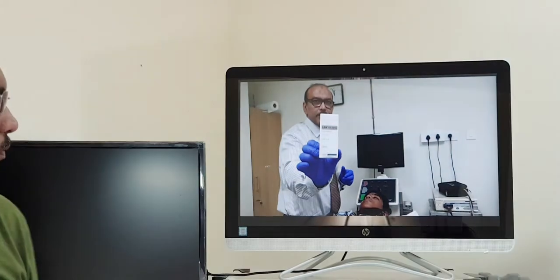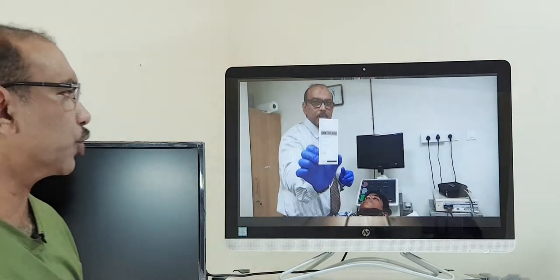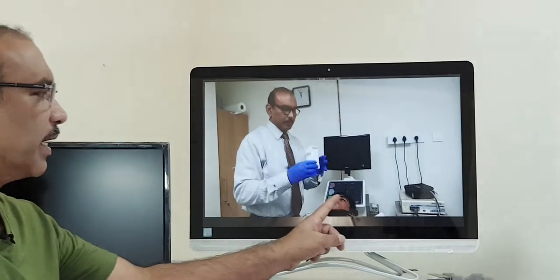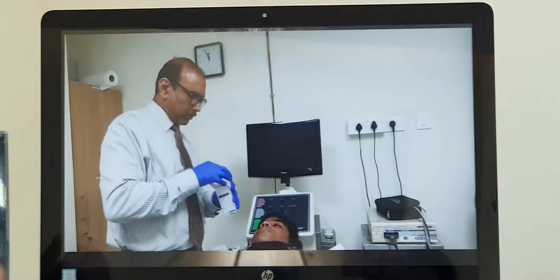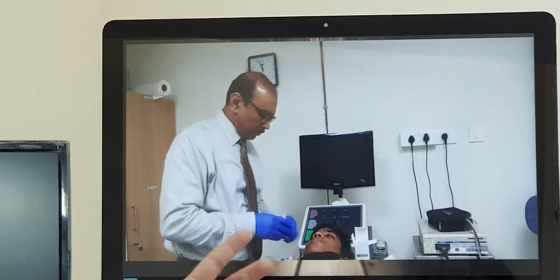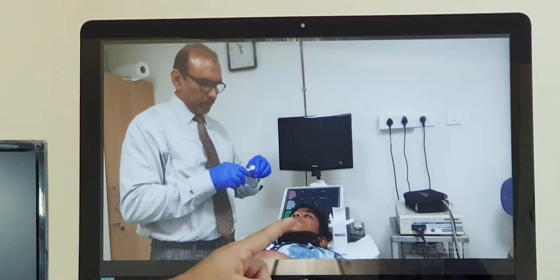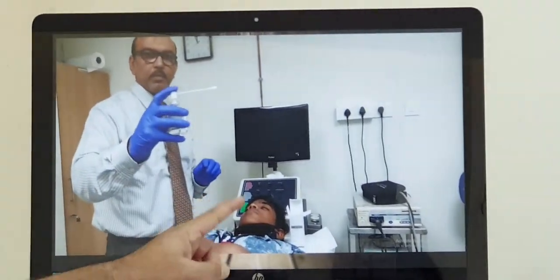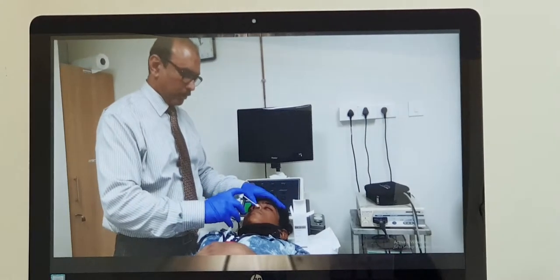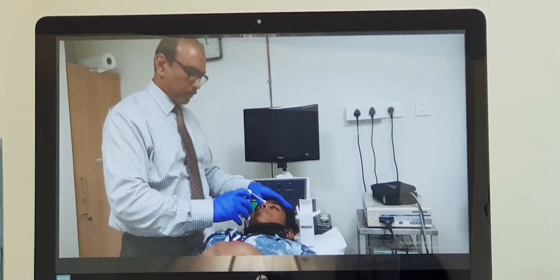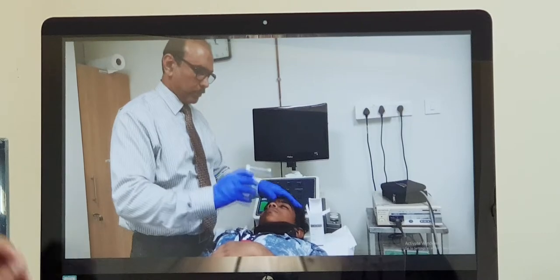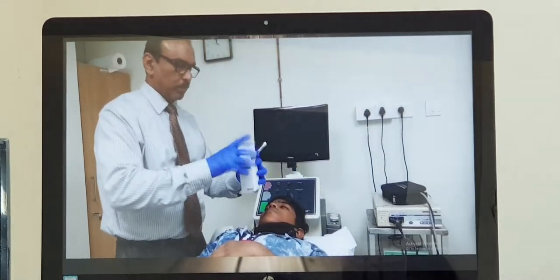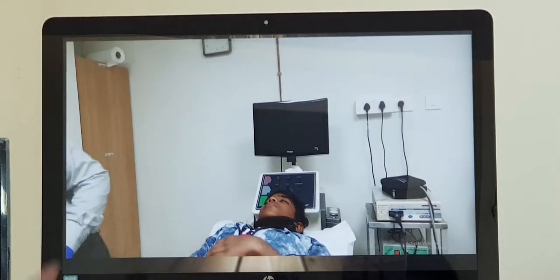Coming to the endoscope preparation. Before doing an endoscopy, we have to anesthetize the nasal cavity as well as the area behind the tongue. This can be done in two ways: either you can spray directly in both nasal cavities, as shown in the video, or you can apply the medication on cotonoids which are then placed in the nasal cavity.